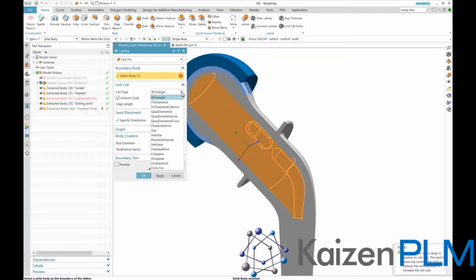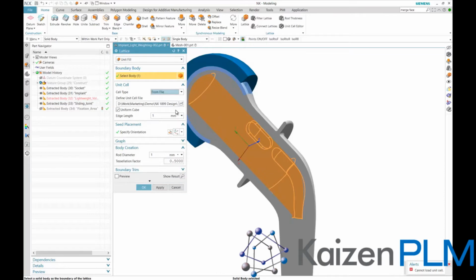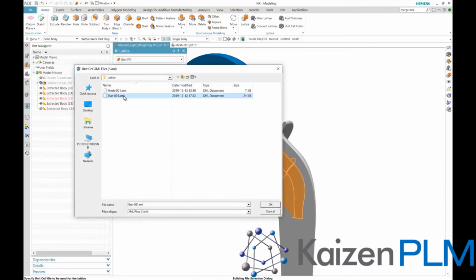We notice that for this version of NX, we have added information such as stiffness and porosity to the existing unit cell library. However, here we have prepared a custom defined cell type to fit our specific purpose. We therefore choose to define the unit cell from File and navigate to the location of our custom lattice type library and select the required definition file.